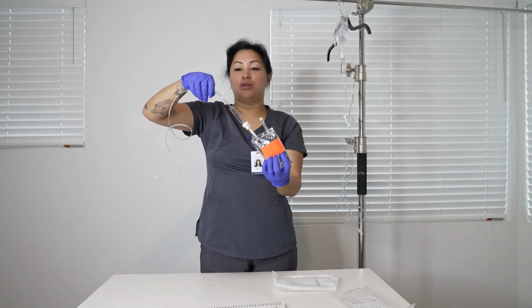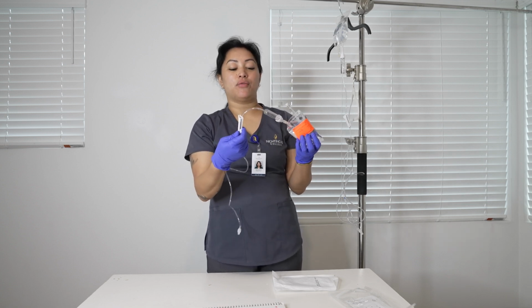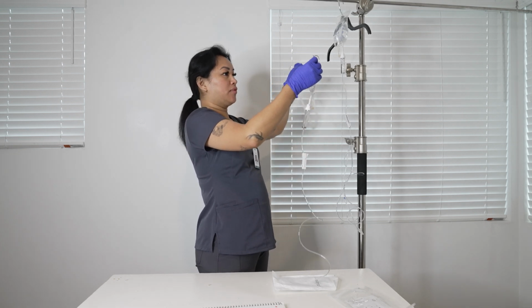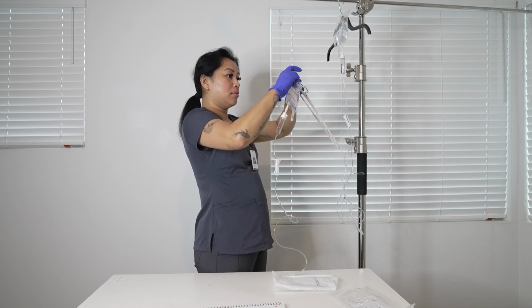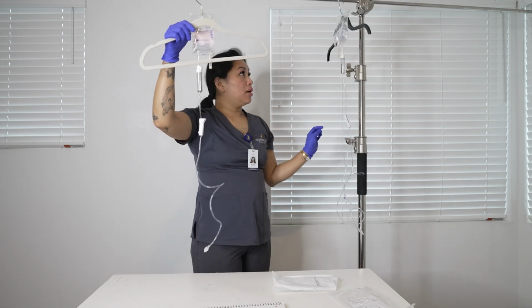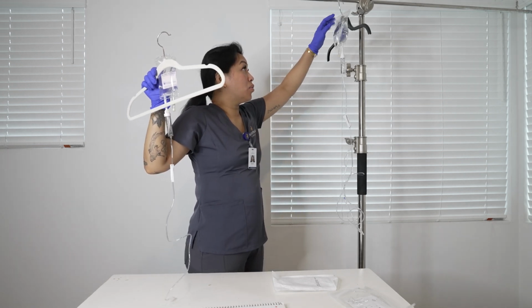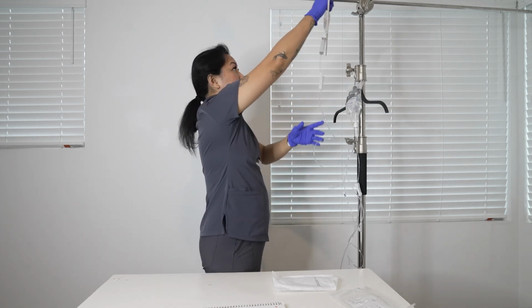Alrighty, so before we turn it over, always make sure that the roller clamp is all the way down to prevent the medication from leaking. So now that it is down, I am going to flip it over, and now I'm going to hang it. Alrighty, so since we are going to be putting the amoxicillin into the patient, I am going to lower the fluid below and I will put the medication higher.